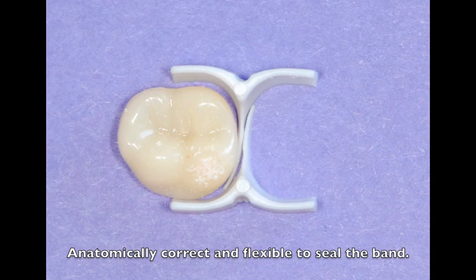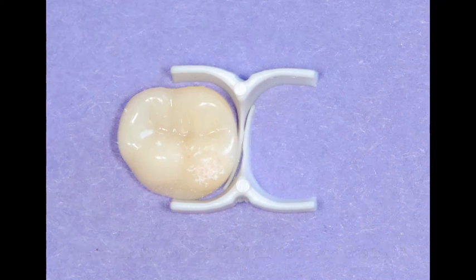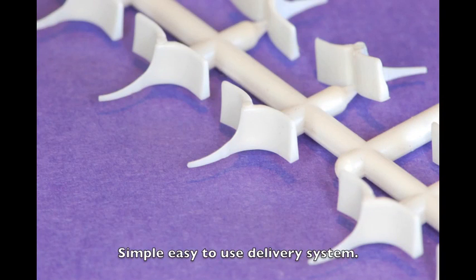The ABC wedges are available in four sizes and available in left and right configurations. They are extra small, small, medium, and large. As you can see, they adapt well to the interproximal space. The tip is flexible enough to adapt to the interproximal surface. This creates a really nice tight seal, preventing any material or flash from extending beyond your preparation. The ABC wedges are simple to use and come in a convenient delivery system.